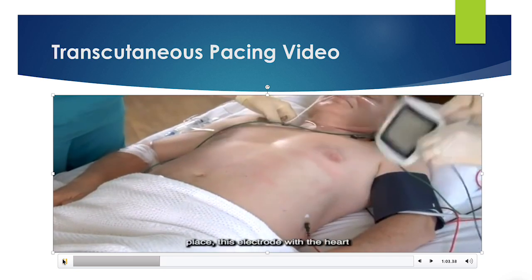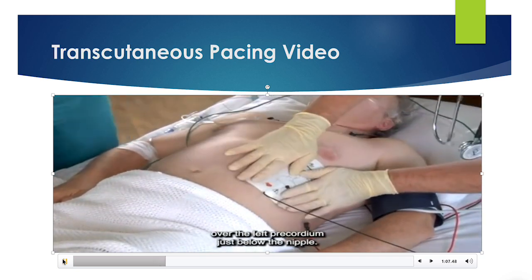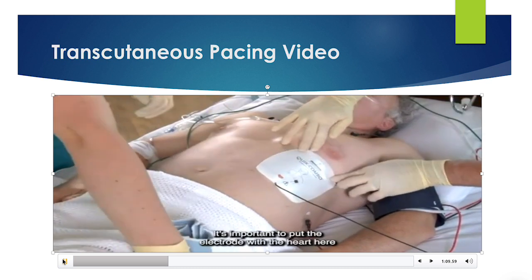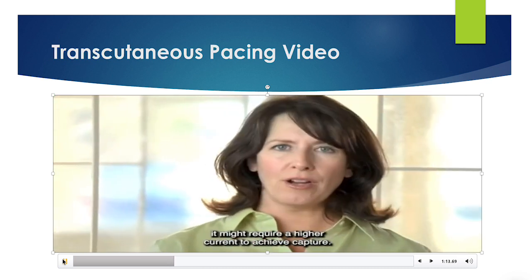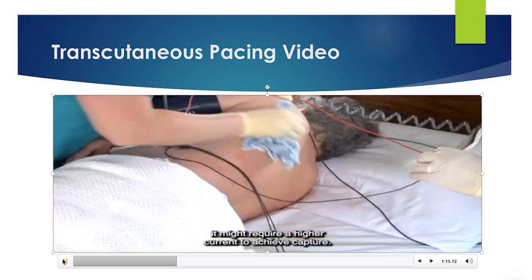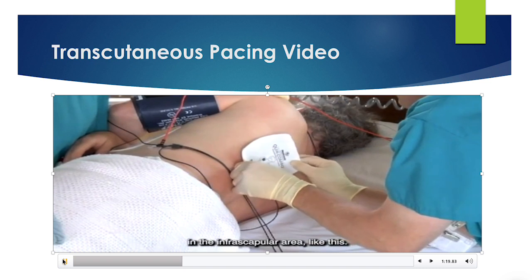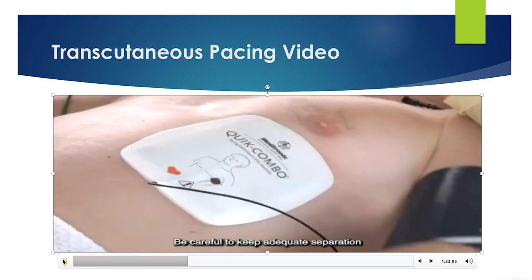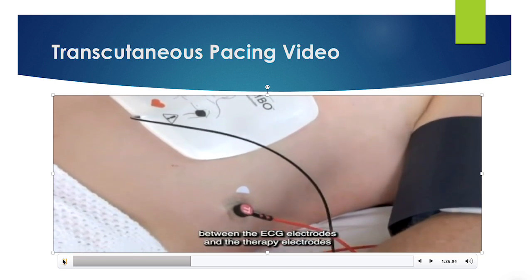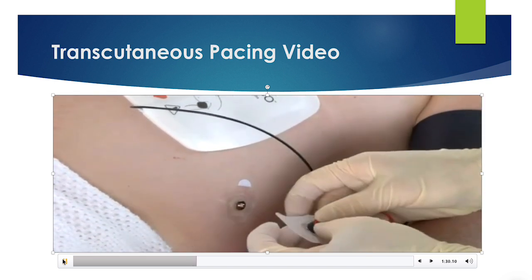Place this electrode with the heart over the left precordium, just below the nipple. It's important to put the electrode with the heart here rather than on the back, because if the electrodes are reversed, it might require a higher current to achieve capture. Place the other electrode on the patient's back, in the infrascapular area, like this. Be careful to keep adequate separation between the ECG electrodes and the therapy electrodes to minimize artifact on the ECG.